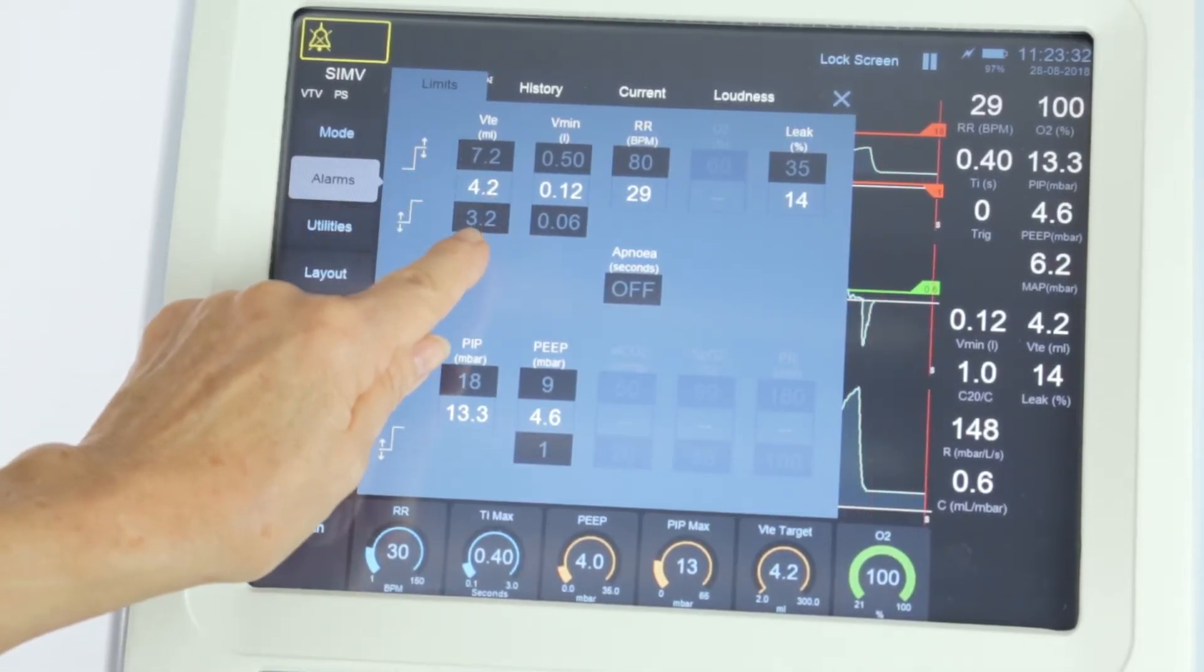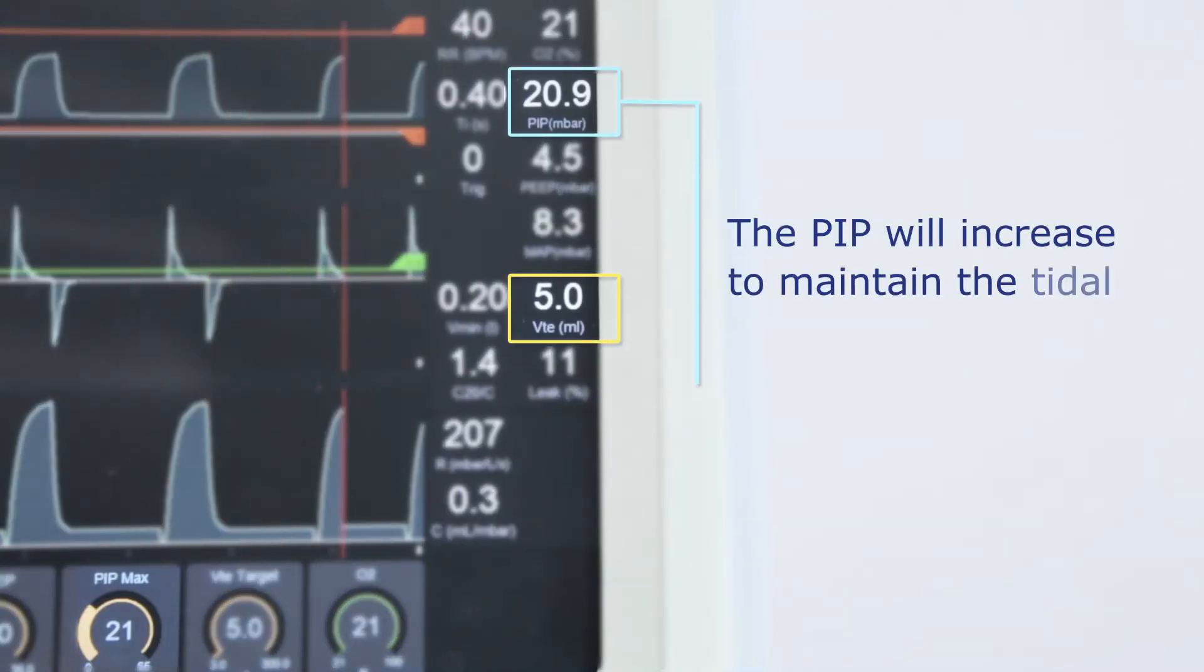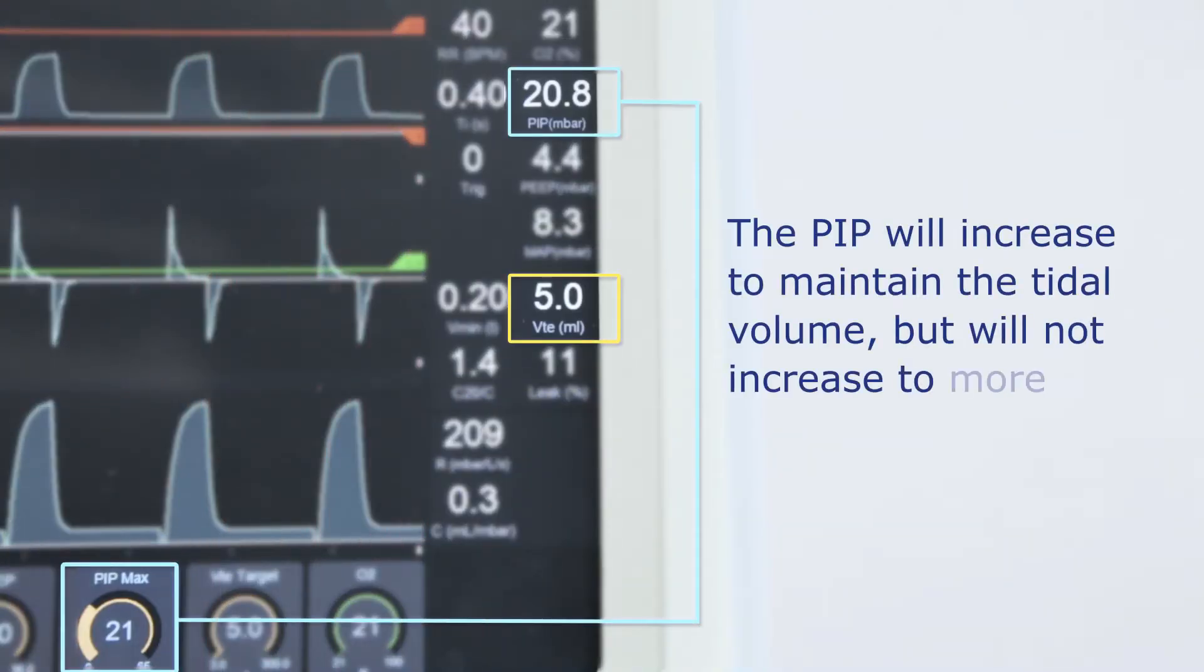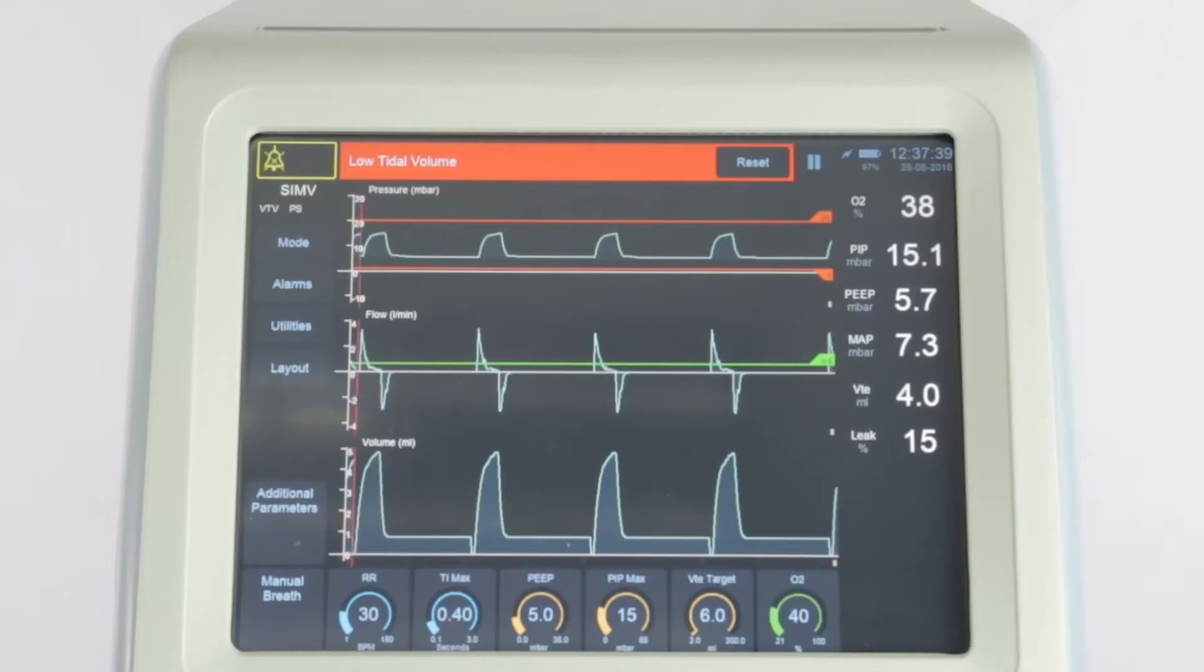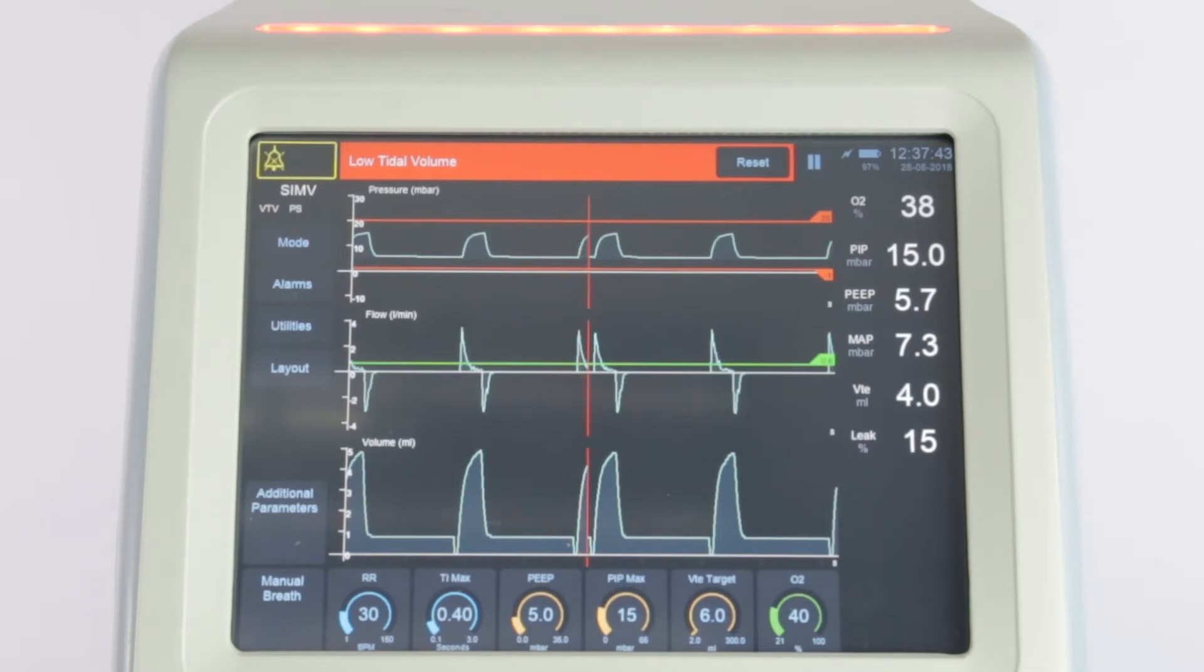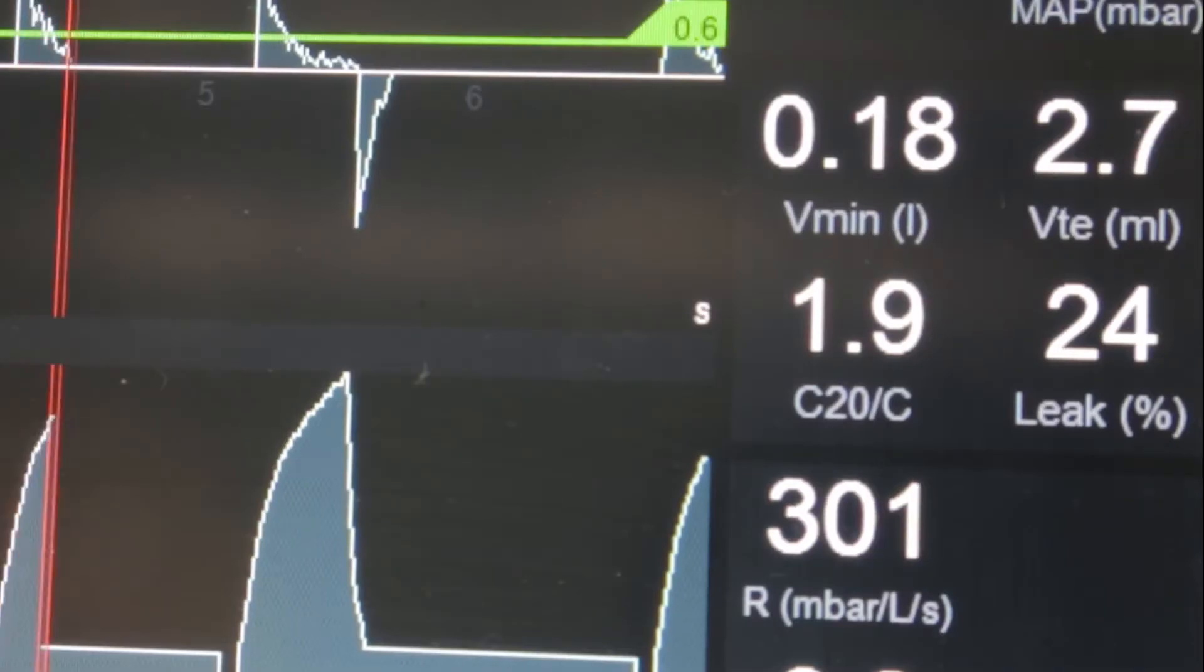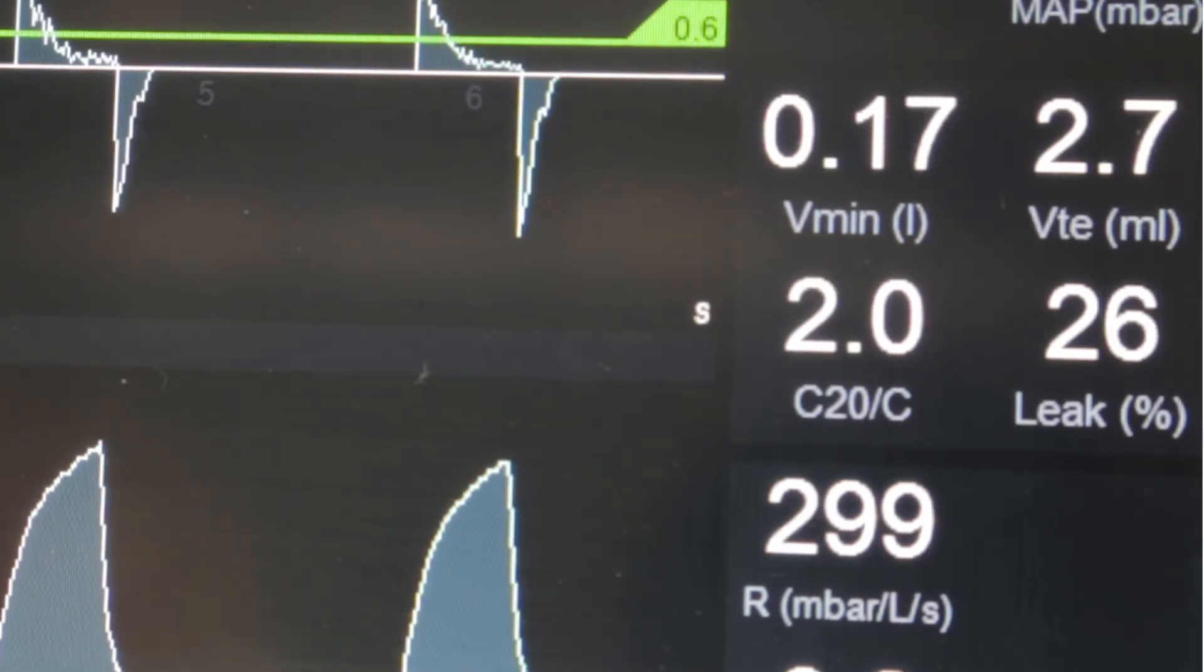Should the resistance increase, the PIP will increase to maintain the tidal volume, but will not increase to more than the maximum PIP. If the tidal volume cannot be maintained by the maximum PIP, a low tidal volume alarm will be activated. It could be due to increased resistance or an increase in the leak.